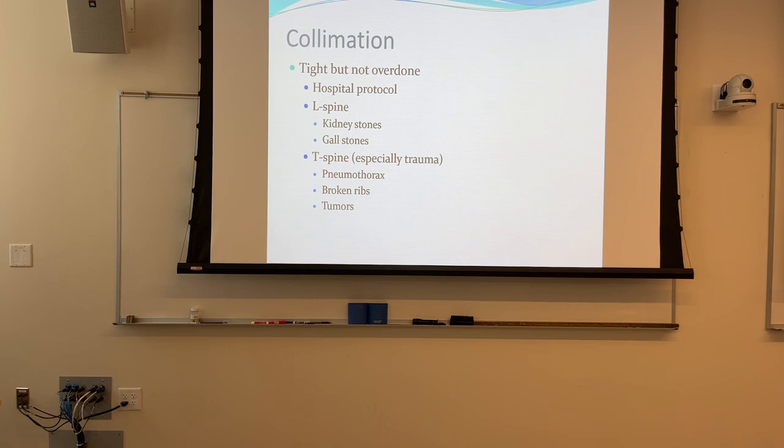So some of your doctors prefer you shoot a KUB for your L spine, but also whenever we're doing traumas, the KUB becomes the AP of the L spine. I'd say probably within the last 20 years, I've not seen an institution that would shoot an AP L spine and a KUB. The KUB becomes AP of the L spine. And the same thing with T-spine. The chest x-ray becomes the AP of the T-spine. So in those cases, your AP of the T-spine is without collimation.